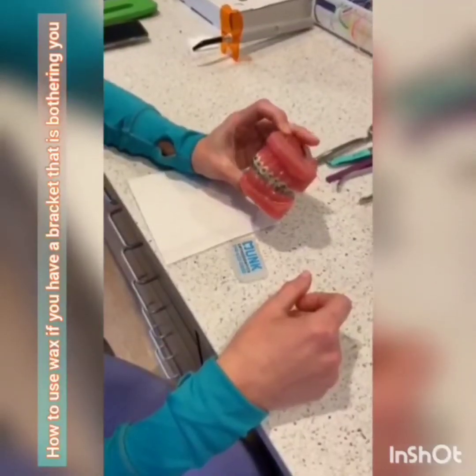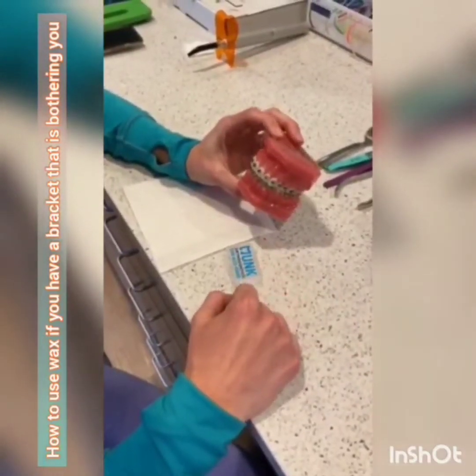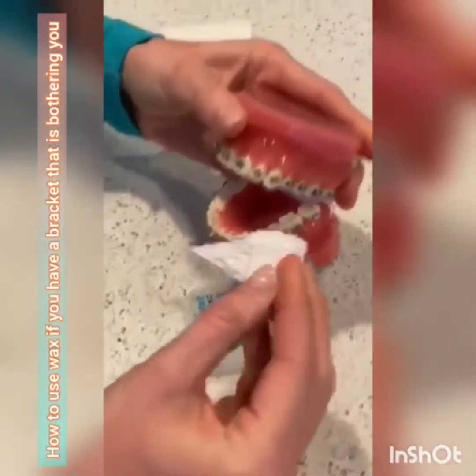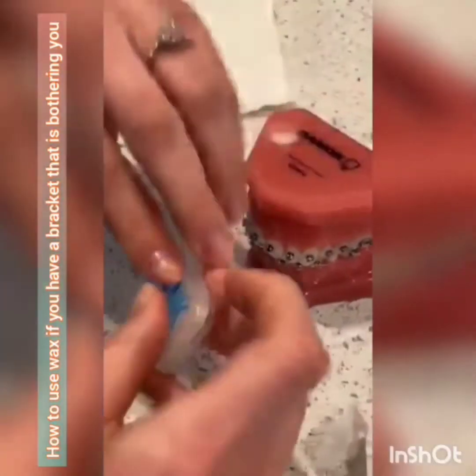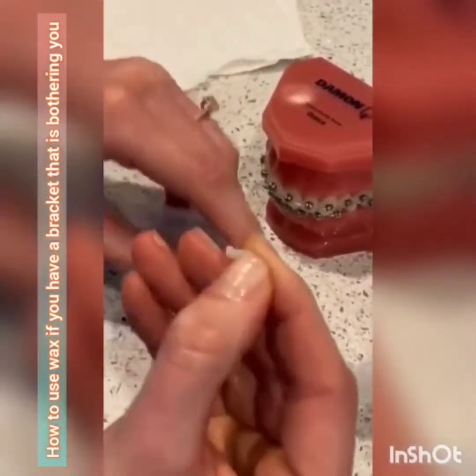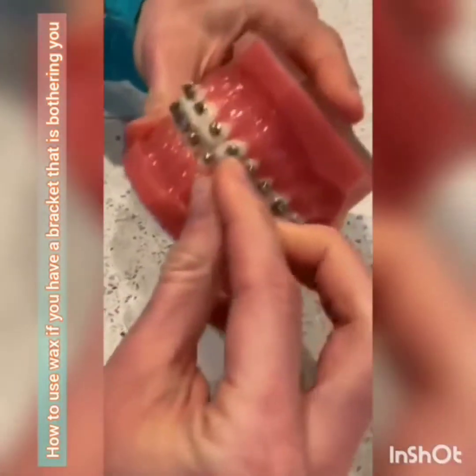So if you have a pokey bracket, you can actually add some wax to make it more comfortable for your cheeks. What you want to do is dry the bracket off with a piece of paper towel or toilet paper. Dab the bracket that's bothering you, dry it off, and then take a chunk of wax and smush it in. Now you want to play with the wax a little bit, make it nice and pliable and smushy. And then you smush it in.